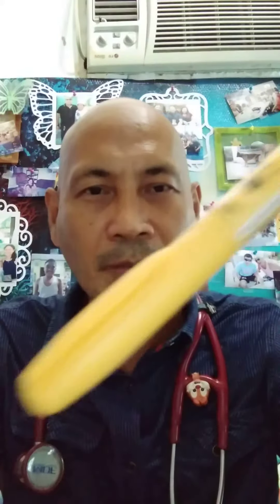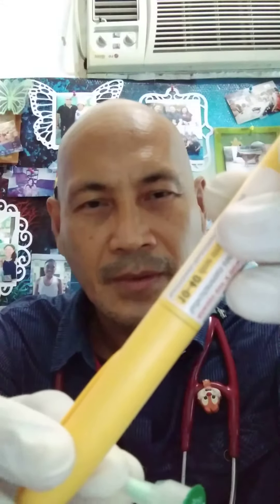So first, this is your insulin pre-filled syringe, and this is your new needle. What you will do is open the cover of your new pre-filled insulin syringe — don't touch this part because it is sterile — and this is your new needle.